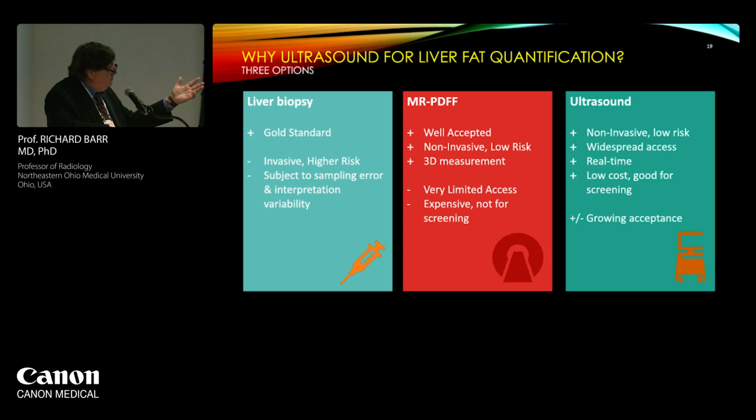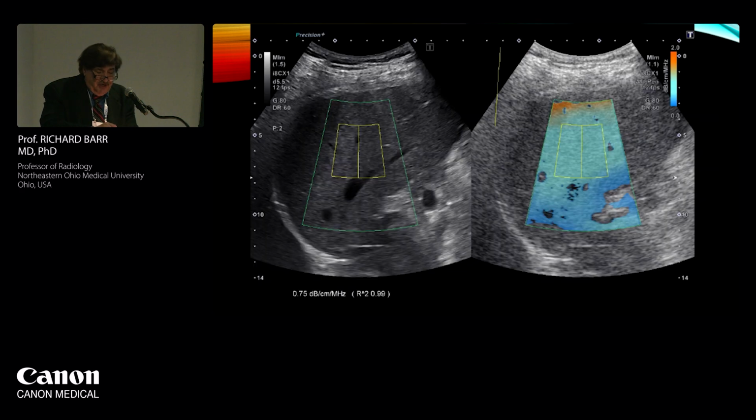So ultrasound is really the method of choice: non-invasive, low risk, widespread access, real time, low cost, and it's great for screening. And there's no reason why some of these can't be put on lower end systems so we could do mass screenings even in underdeveloped countries.